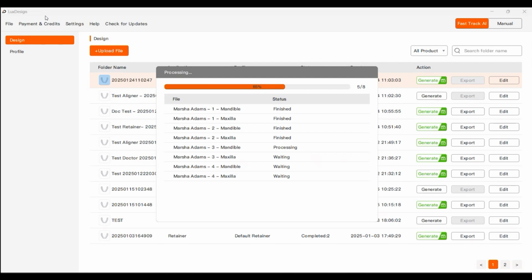A really nice thing about the fixes and features is that with our support website, you can always generate tickets to actually make feature requests for the software as you begin to use it and you notice things that could be improved or that you'd like to add. You could always generate a feature request with us at LuxCreo support from our support website, by emailing support@luxcreo.com, and we will take that into consideration. And oftentimes, doctors will see their suggestions reflected in new updates of the software.